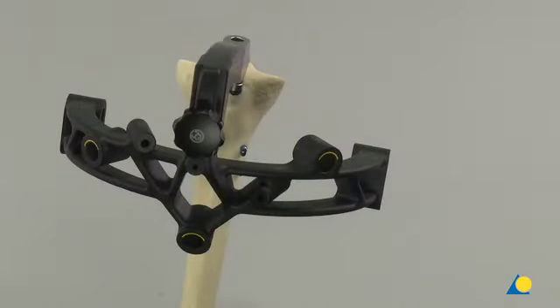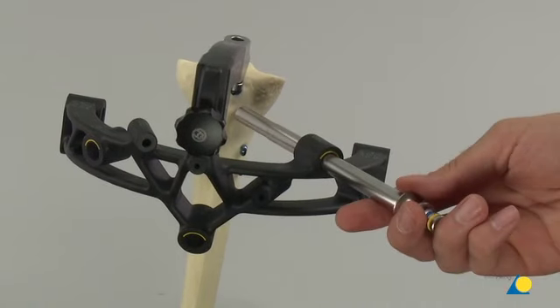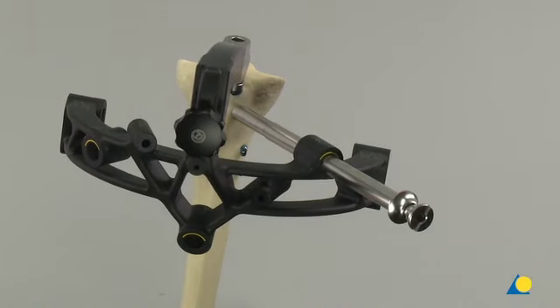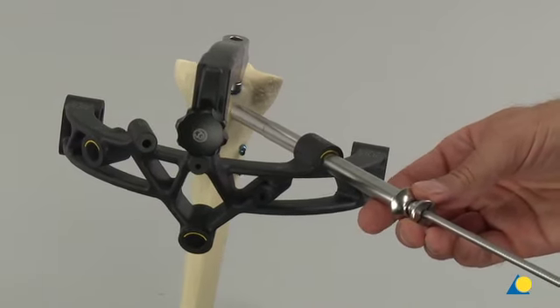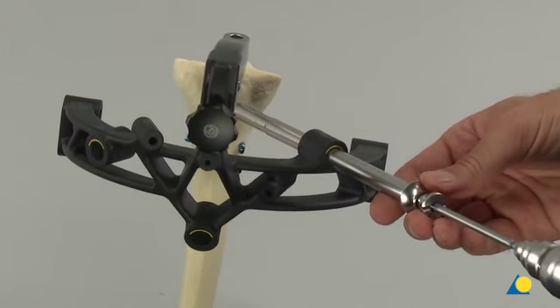The three-part trocar combination is assembled and inserted through the hole in the aiming arm marked oblique 1 through a stab incision down to the surface of the bone. The trocar is removed. While ensuring that the drill sleeve is pressed firmly to the near cortex, a 3.2 mm hole is started. Drilling is stopped immediately upon penetrating the near cortex.